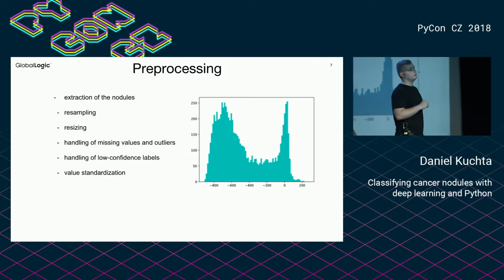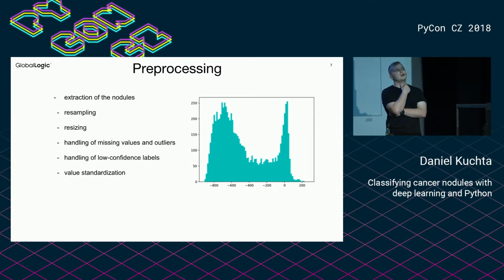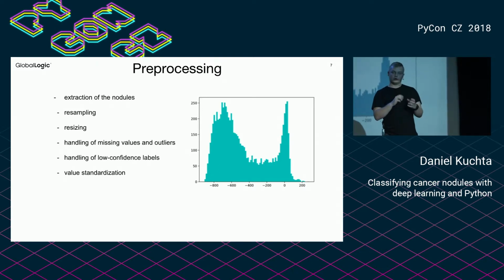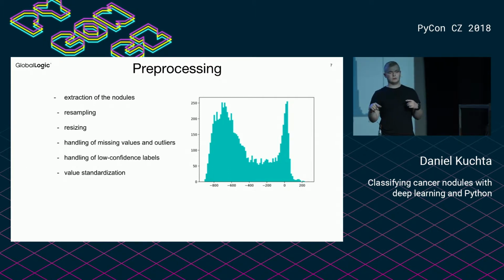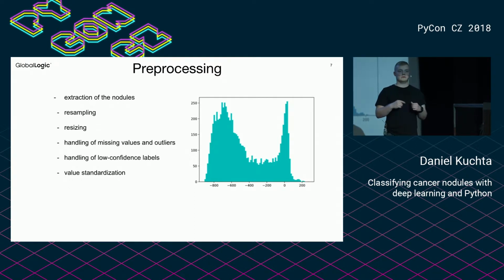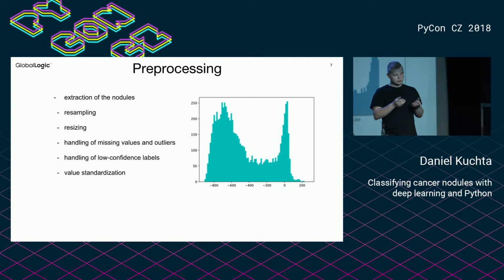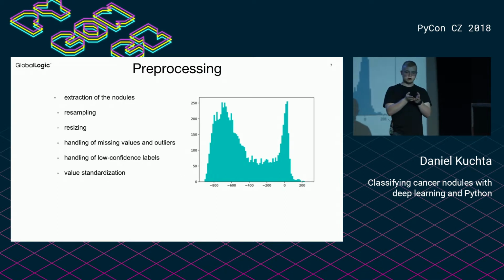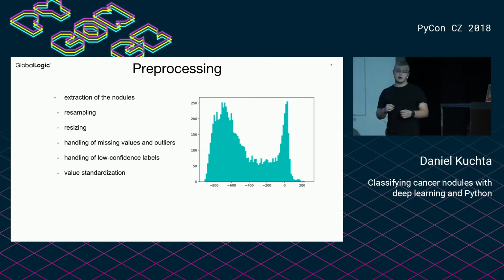So what we did was that we used this training data to train a 3D convolutional network to do a rough estimate of what a nodule could be. And then we built another network, a simple feed-forward neural network, to make the predictions smoother, so we could actually get very, very good results using our automatic segmentation.